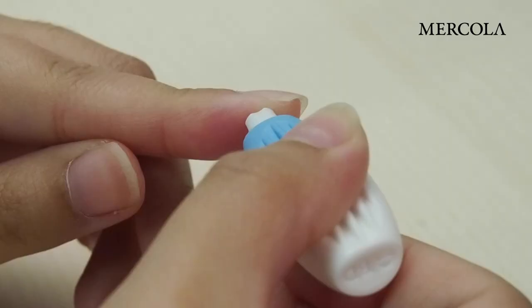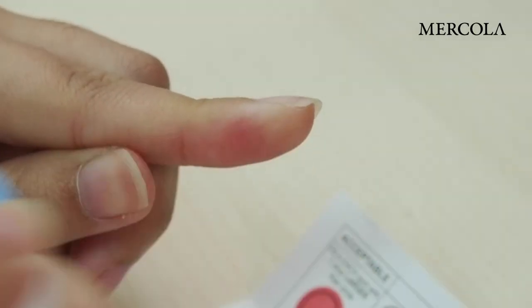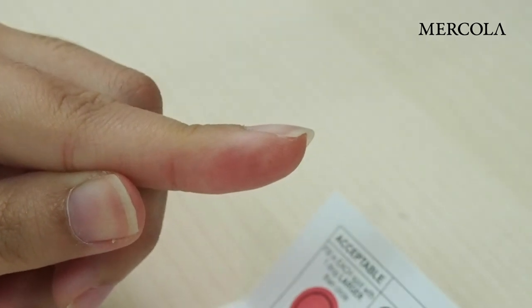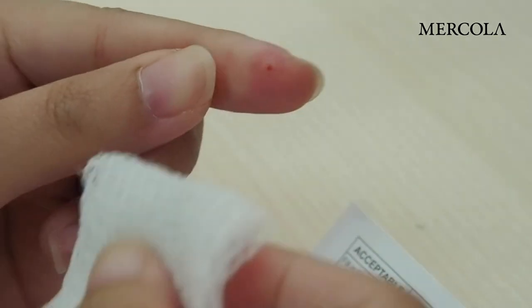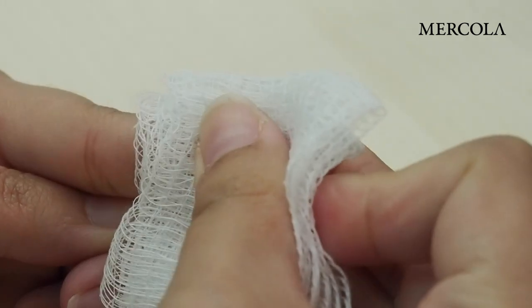Press the lancet against the side of the finger until you hear a gentle click. Immediately wipe the first drop of blood with the sterile gauze pad one or more times. This will help the blood flow.